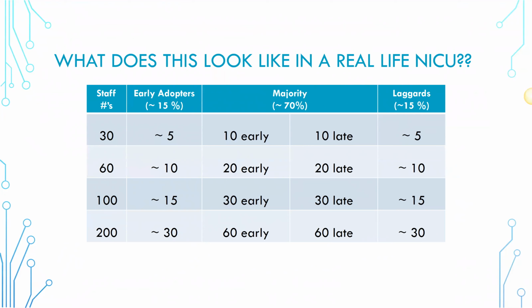So all of the devices have a way to look at the impedance level. So how are you guys doing with your impedance? Is there room for improvement? Could you do better? How often is it stable? We did a poster presentation 3 or 4 years ago at the Florida International Conference, where we showed that we could teach more than 50 nurses how to put on aEEG leads, and that we could have clinically stable impedance levels.